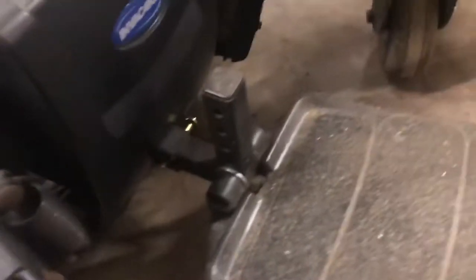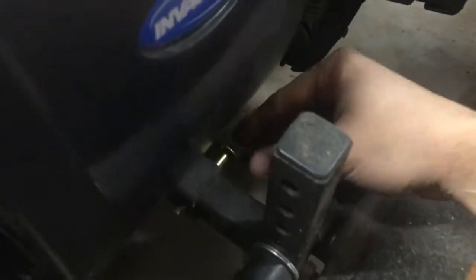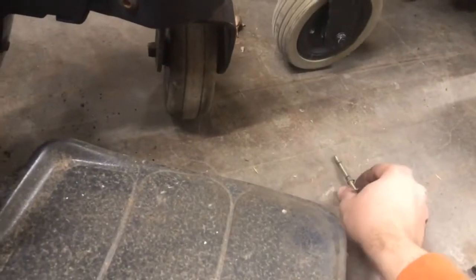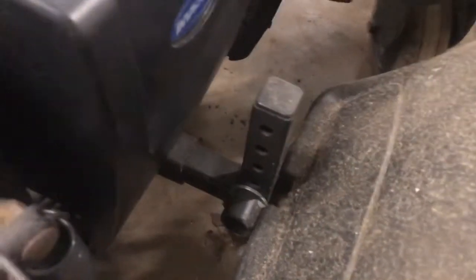Okay. So I'm gonna turn this chair around. Don't lose my Allen's here. Okay, let me give you the angle here. Okay, so here's the foot plate. You have this brass plug. All you have to do is press it in and then pull it out. If you ever lose that, screw in a nut. They want too much money for that. Then this should pull out.